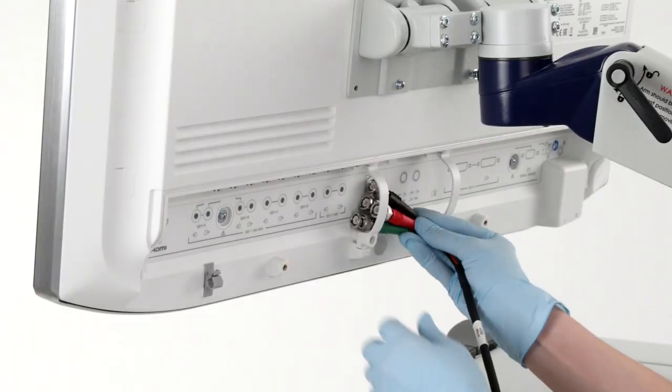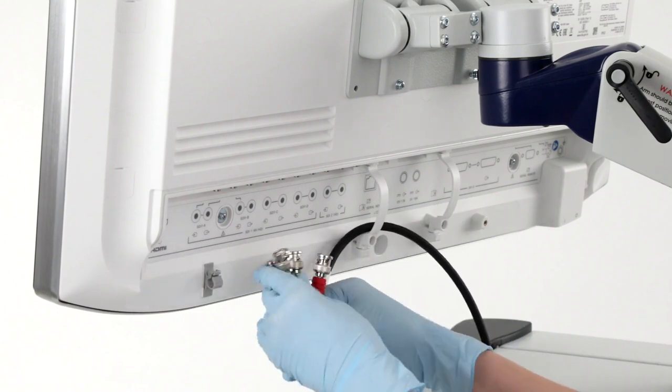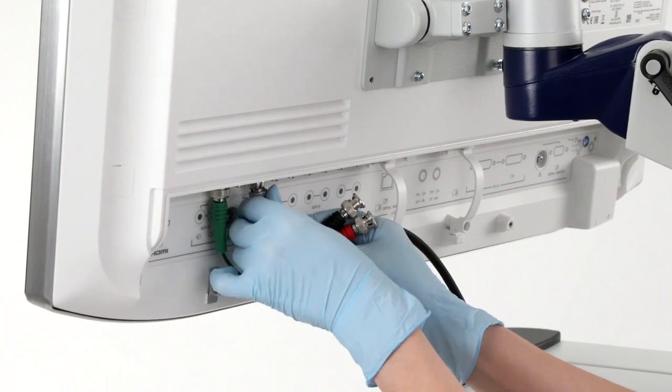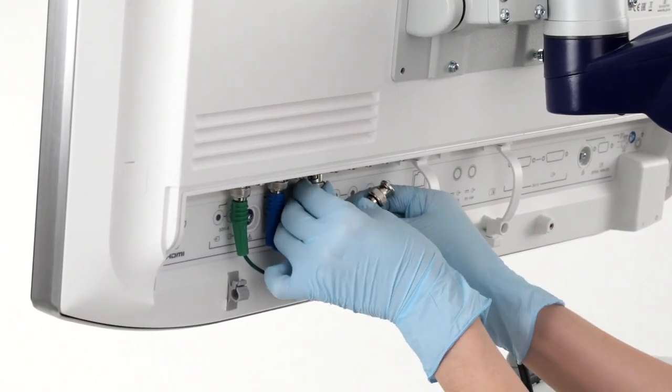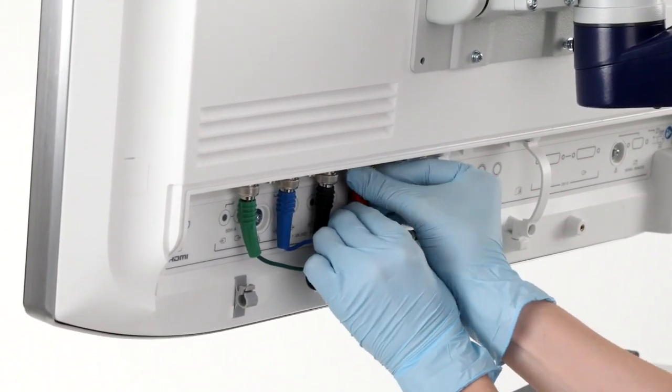Next, you'll need to route the cables from the CCU to your monitor. Be careful to avoid tripping or entanglement hazards during this step. Secure the cables at both ends to avoid inadvertent disconnection, and make sure cable sequencing is correct to avoid an improper image being displayed on the monitor.